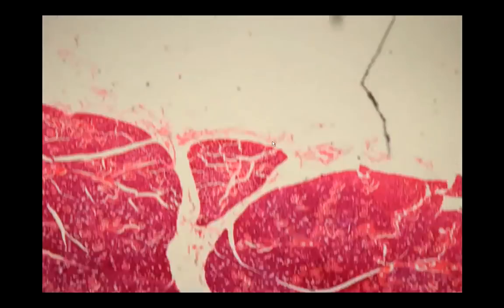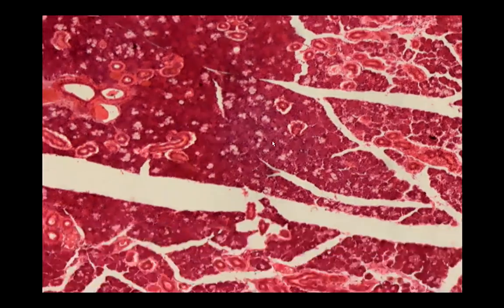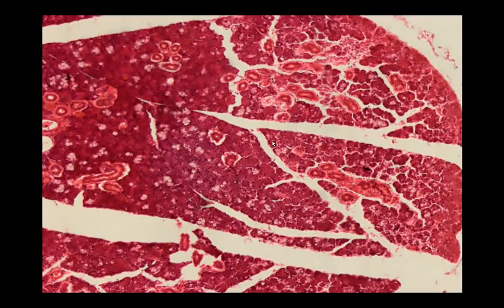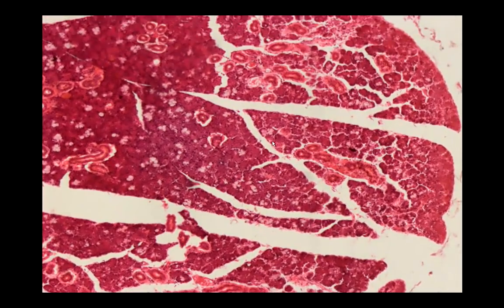So if we go to the submaxillary gland, it has a different acinar composition. If the parotid is pure serous, this would be a mixed type, composed of serous and mucous acini.